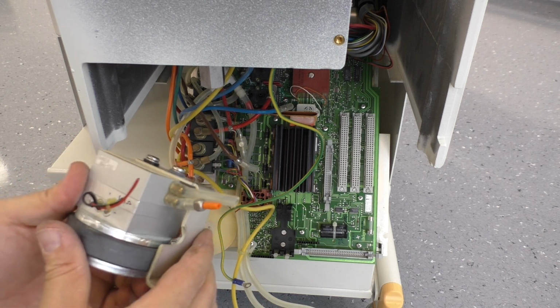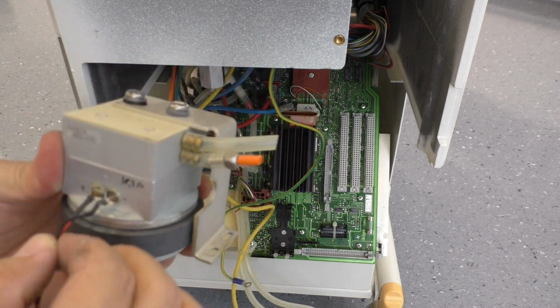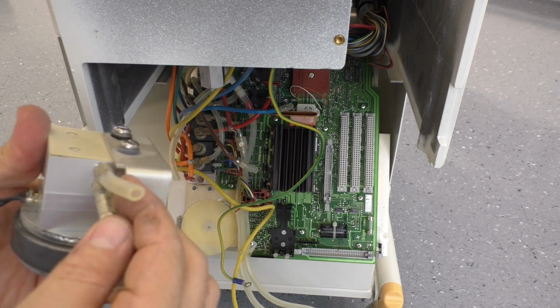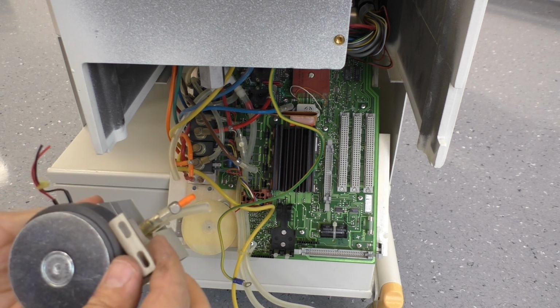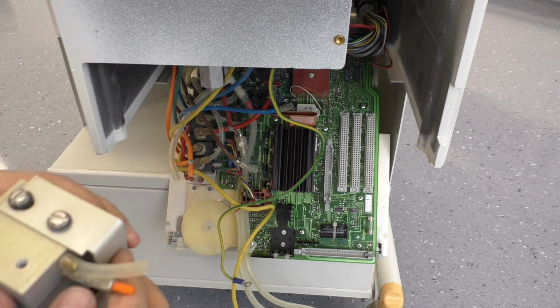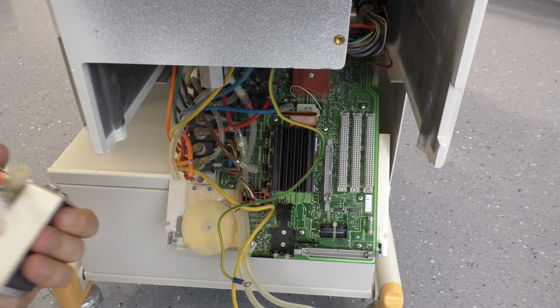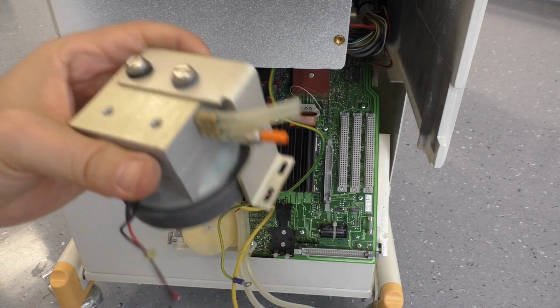Okay, it says 38.3 ohms, whatever that means. It has two connections, maybe an input and an output magnet. So I think this is an electromechanical pump, maybe. Let's see inside.